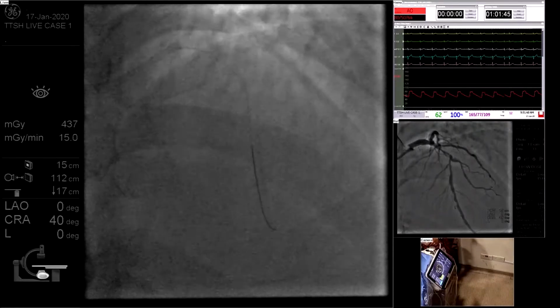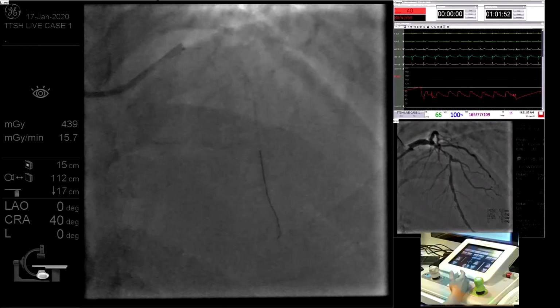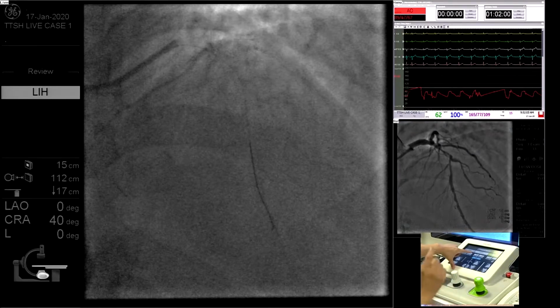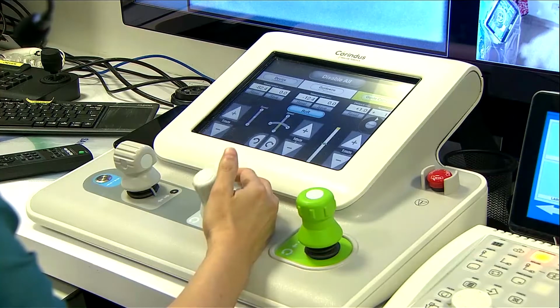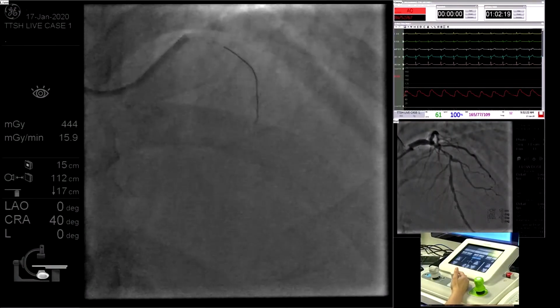Deborah, can you give me a little test? Okay, so a little bit far, so I'm going to go back a little bit. Okay, test that for me. So if this is a good, reasonable distal landing zone, now can you look at my hand? I can reset this wire position to 0. Now I will pull this wire back to where I think I want to stop. So I'm just pulling back, 10 mm, 15, 16, and I'm just pulling the wire back. Okay, I think this is roughly right.